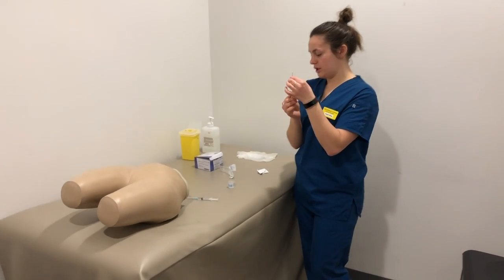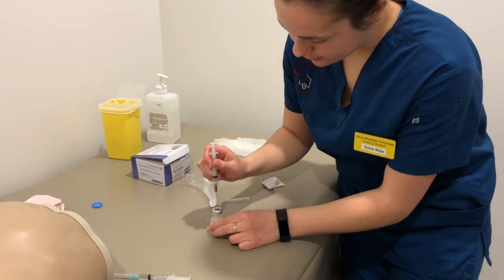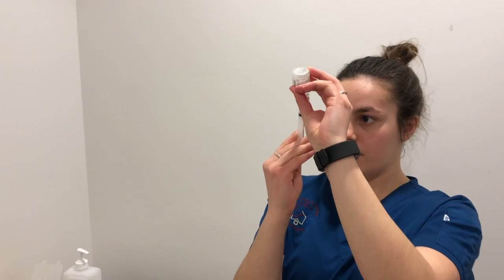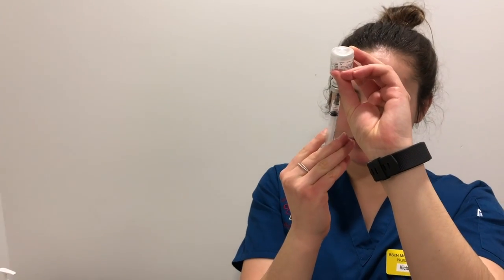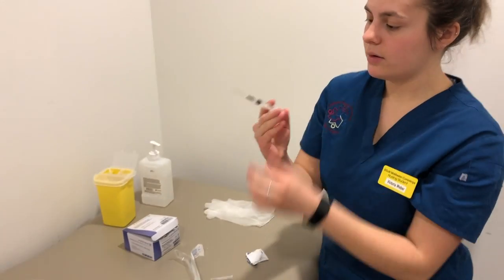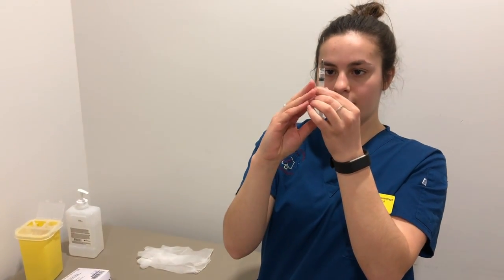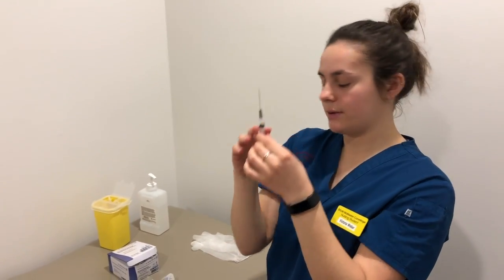I'm going to remove the sheath. I'm going to go into my vial, inject the air, and flip. And I'm going to guide that with my thumb, although the positive pressure will also bring the plunger back. So I will remove that, tap my medication to get any air bubbles to the top, and remove the excess, allowing the air bubbles to go out.